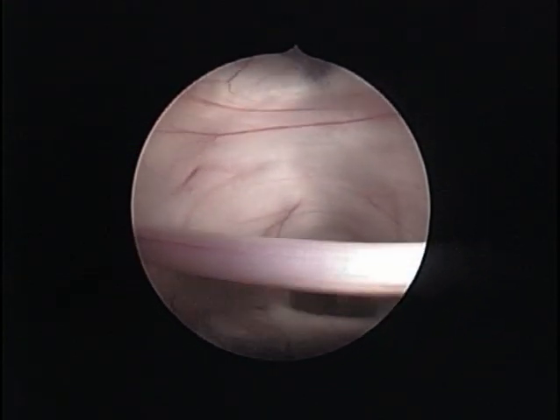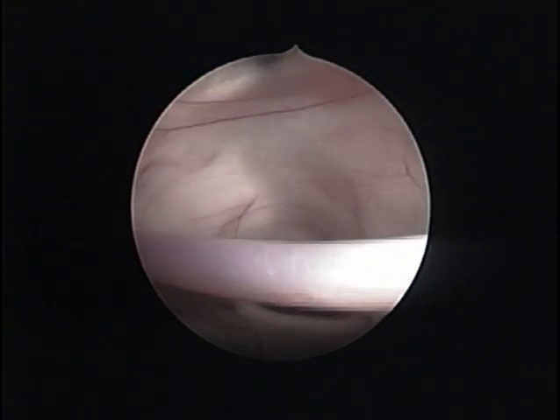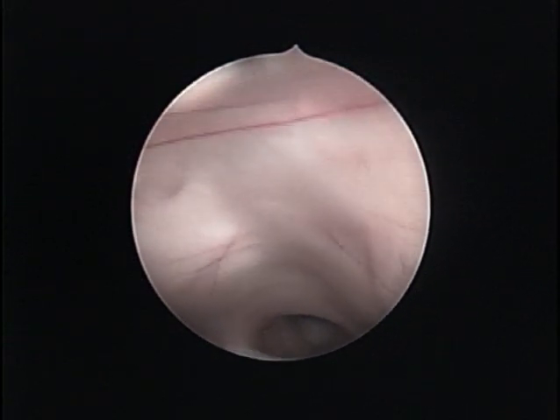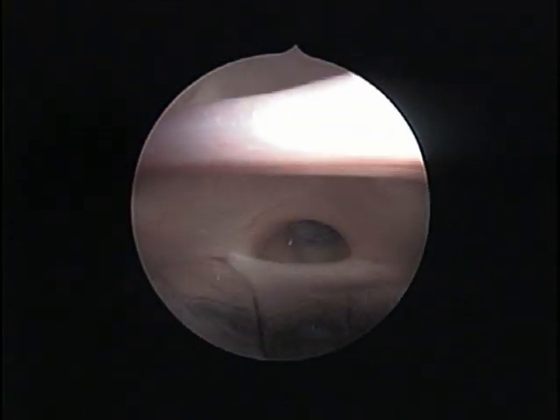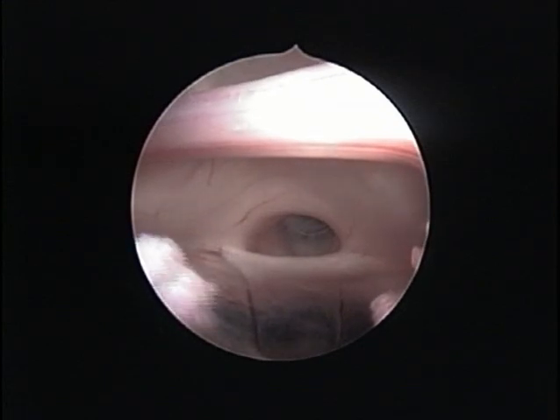The first visible structure is the interthalamic adhesion. Passing under this structure, the opening of the dilated aqueduct of Sylvius becomes visible, bordered on top by the posterior commissure. Passing over to the other side of the commissure, one has a perfect view of this posterior commissure, and above it, below in this picture, the tela choroidea of the third ventricle.